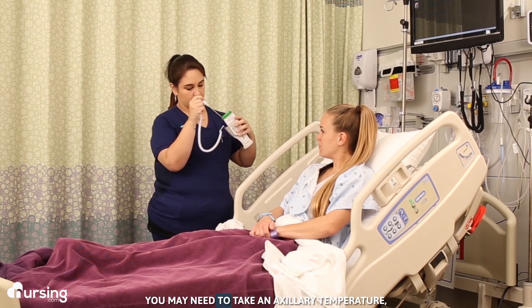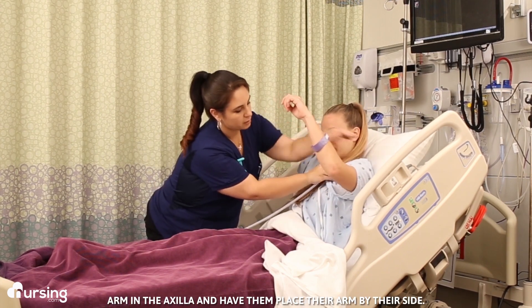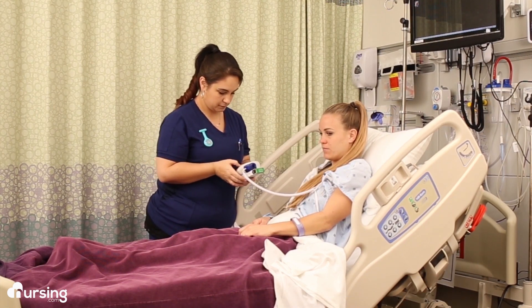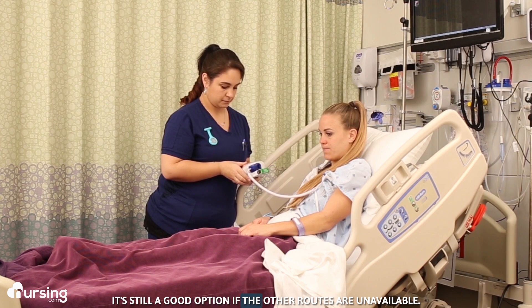In some cases you may need to take an axillary temperature. Place the covered probe under the patient's arm in the axilla and have them place their arm by their side. Make sure you get good contact with the skin. This isn't the most accurate temperature — it usually runs a full degree lower than oral — but it's still a good option if the other routes are unavailable.